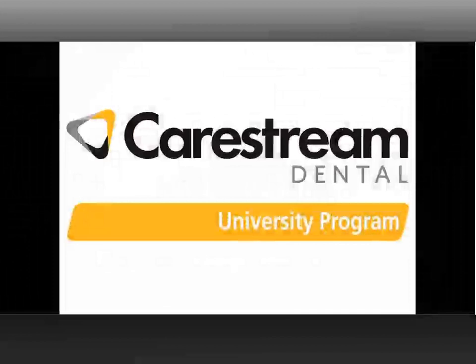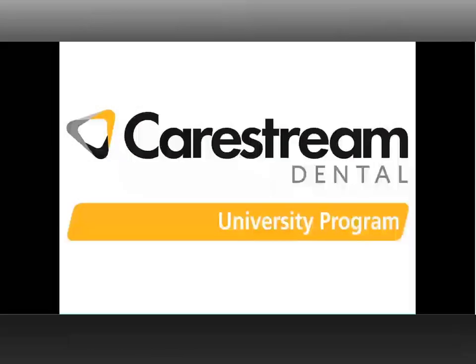Dr. Kottal, before you begin, I'd like to introduce you. Dr. Shailesh Kottal is an oral and maxillofacial radiologist. He trained at the University of Missouri, Kansas City, and is a clinical assistant professor at New York University's College of Dentistry, where he operates all advanced imaging services. Dr. Kottal is currently the Director, 3D Imaging for CareStream Dental. Dr. Kottal, welcome, and thank you for taking the time to join me to do this review.